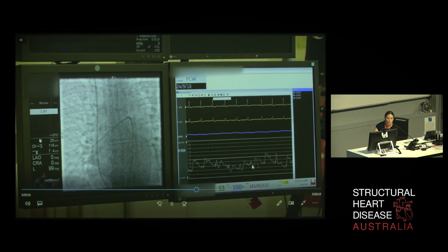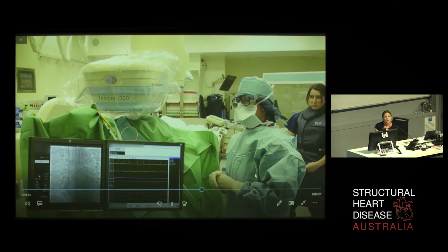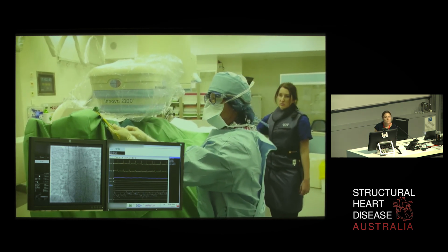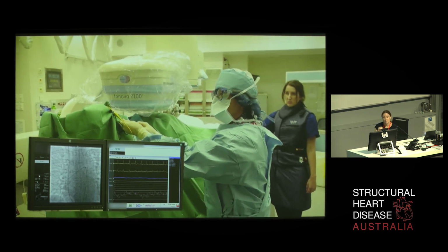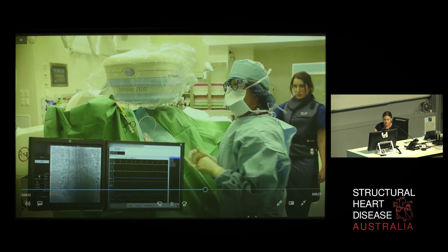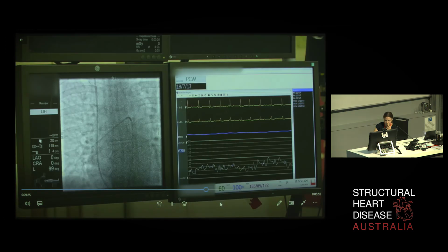So I've decreased the balloon. It's come down a tiny fraction into a wedge, but not a very nice wedge. You can see a tiny bit of whip in the trace at times there. I really would like to see that slightly better. So I'm trying gently to lower the balloon just a fraction to enable it to wedge a little better and make the trace look better, because the whole diagnosis is dependent on the look of that trace and what the wedge pressure is. It's very important. And just see if that helps it slot into wedge position.